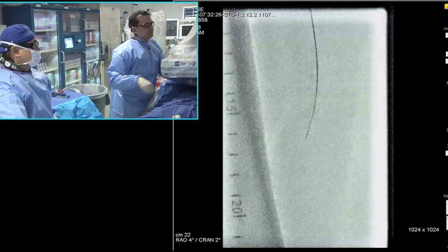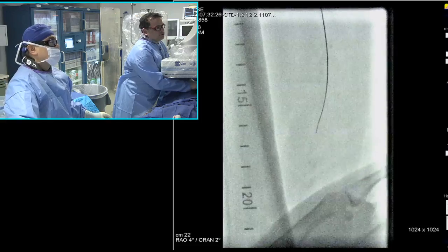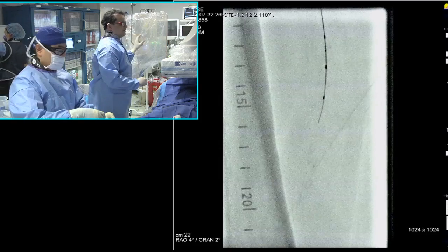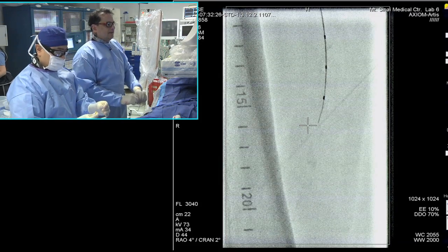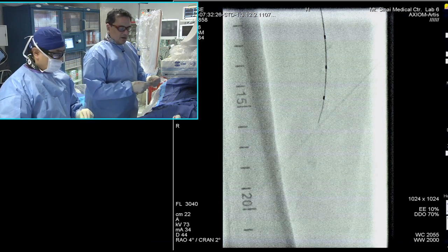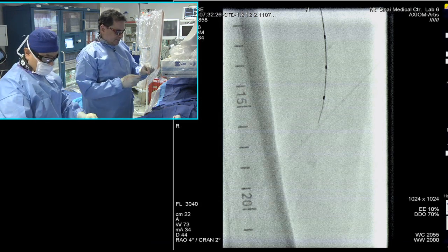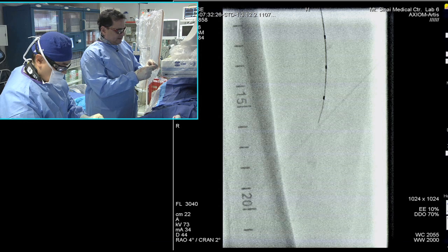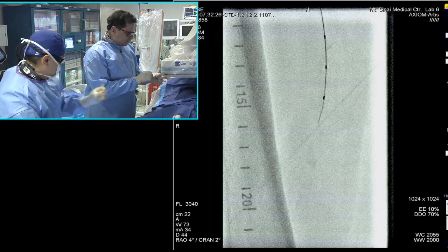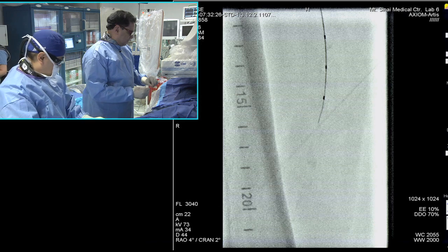So the issue is that we have a lot of other information now that we can use to treat these patients. In the past, we were kind of left with atherectomy and ballooning and stenting, and that may or may not be enough for these types of lesions. We know that in the intermediate term, these patients did quite well, but in the long term, meaning greater than a year, these patients did not do well at all. So I think this is an interesting time to bring up a case like this to really see what we can do.